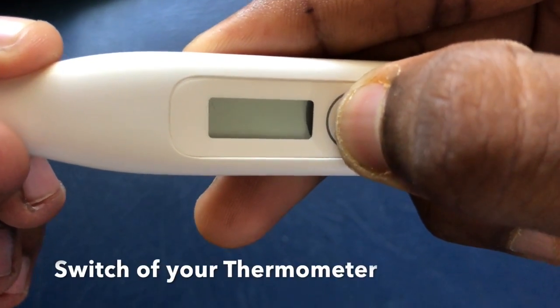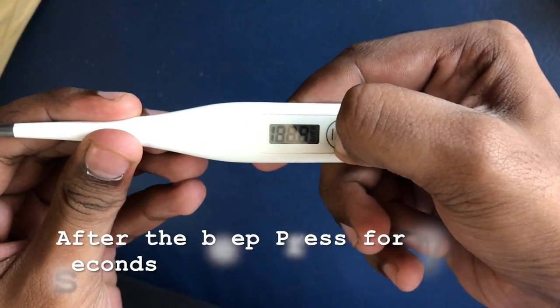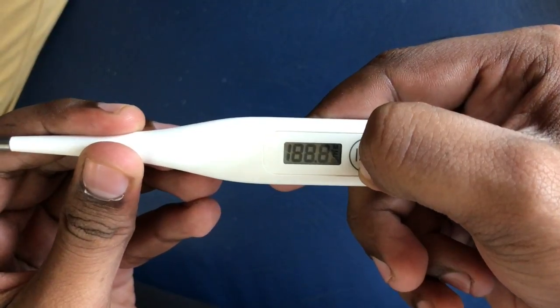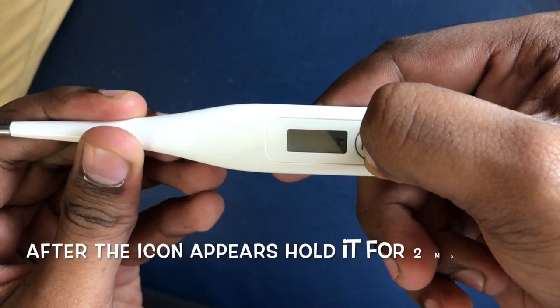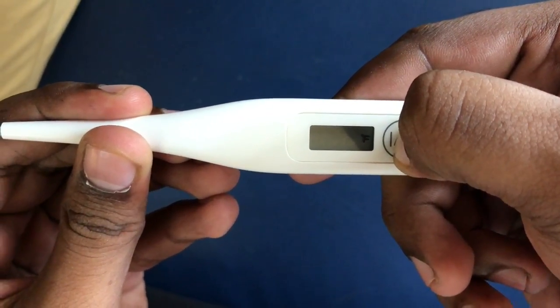First switch off the thermometer. Then press the power button and hold it for 7 seconds. You will see an icon either Celsius or Fahrenheit in the display. Now make sure you hold it for another 2 seconds without releasing it.